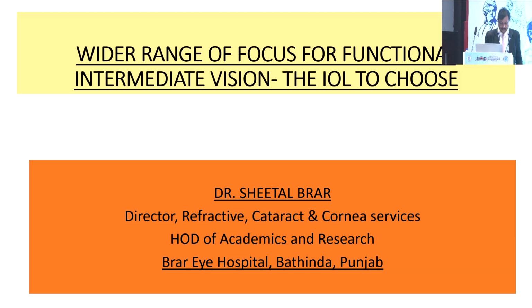Sonu, what do you think the advantage of this textured haptic surface of this lens? I think, sir, this gives you the rotational stability when you're talking of rotations happening in most of the IOL platforms. I think the industry has actually addressed the rotation by making the haptics a little textured, and once the fibrosis happens in the periphery, that gives you that additional stability, and the lenses are really there where you want them. It will be useful for toric lens platforms much more. Yeah. Okay.